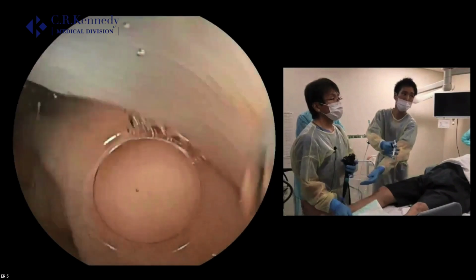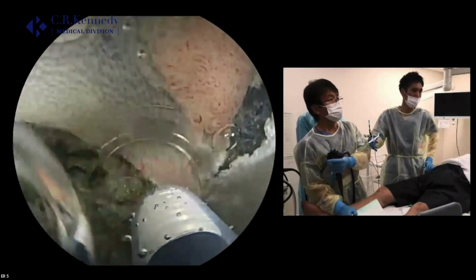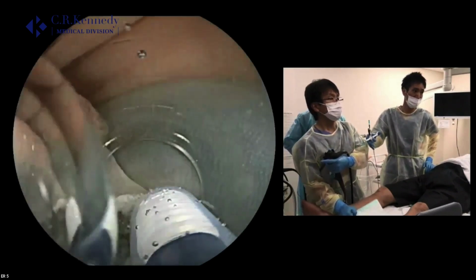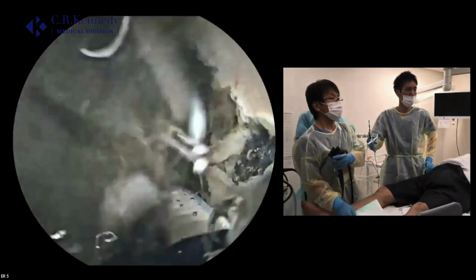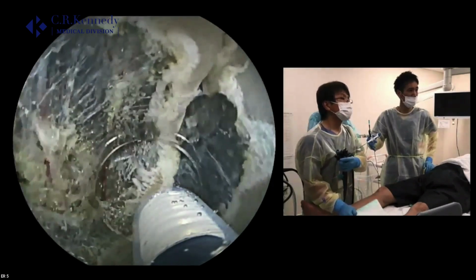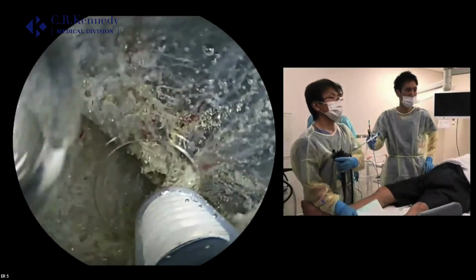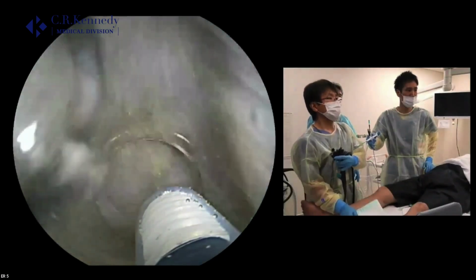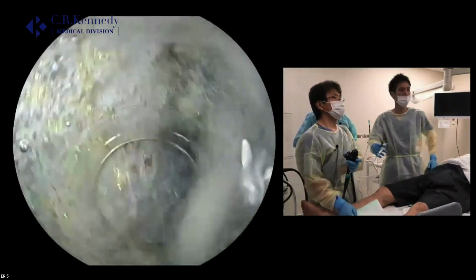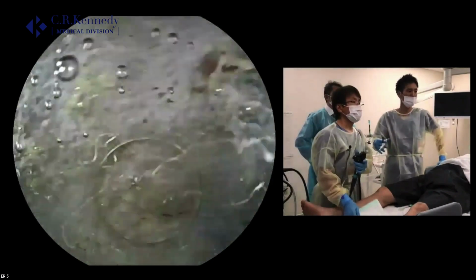And in the water, in the saline, the specimen floats. So it's easy to cut the remaining mucosa, and even if I cut this side completely, I can still have a good view, good operating field on the other side. If that were in gas, it collapses, but in the saline, it floats.